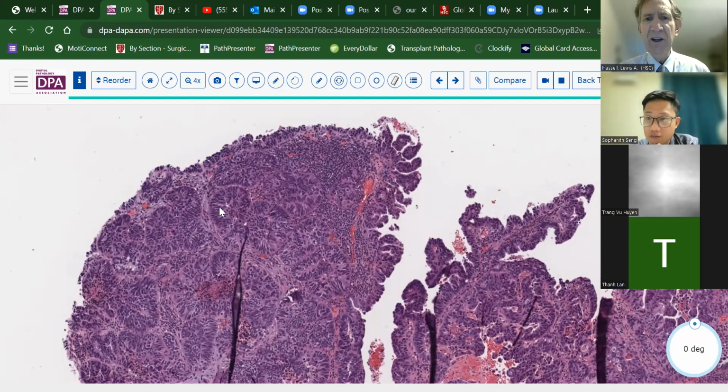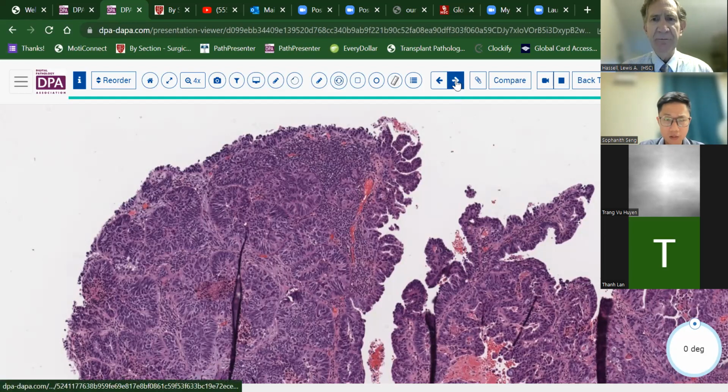And that's where the P16 can be very helpful. If the P16 is diffusely and strongly positive, that's an indication that you have a mutation going on in the cells, and likely in this case is not an HPV related mutation. It's a P53 TP53 mutation that likewise highlights and accentuates the expression of P16. So that's a little bit of a clue to avoid the pitfall of falsely undercalling a null type P53 stain.